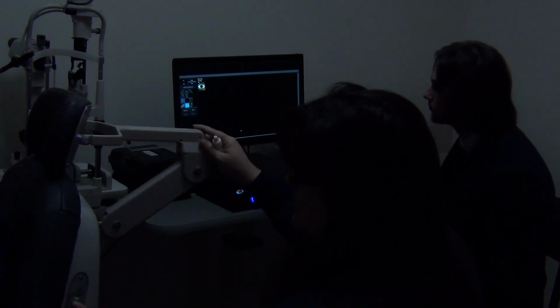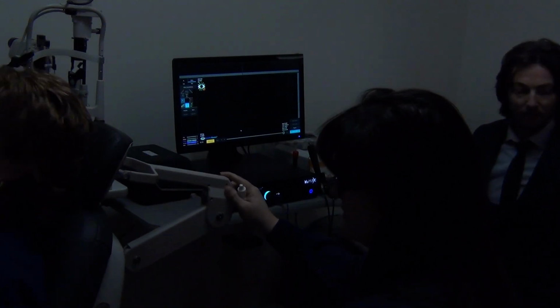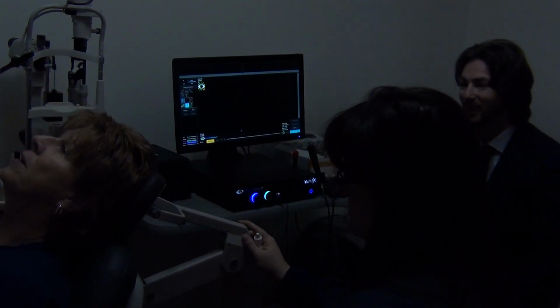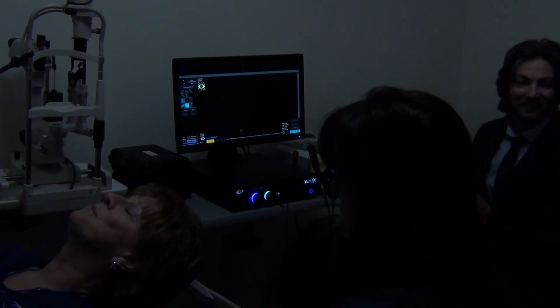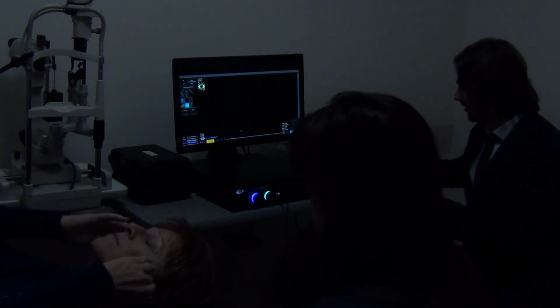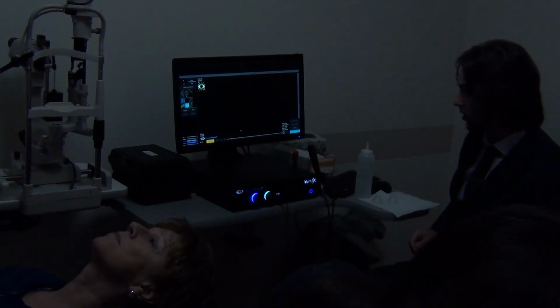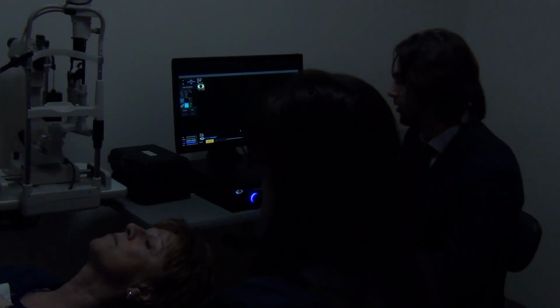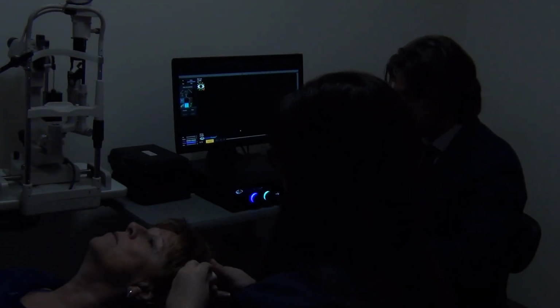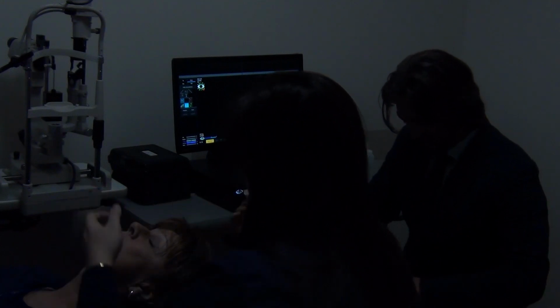You want to lay down? So we have to go all the way back when we do it? Yes. Just don't fall asleep. Okay, I'll try. Thank you so much. So, we're gonna do just the right eye. Let's put a few drops in there. I'll have a tissue box here. Thank you. We may need more tissues. Yeah, we have lots.